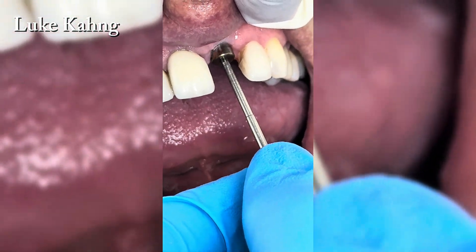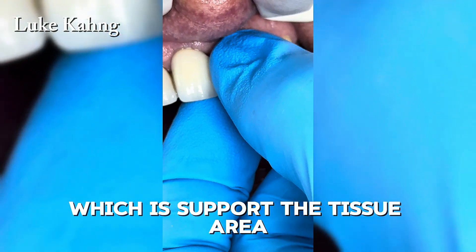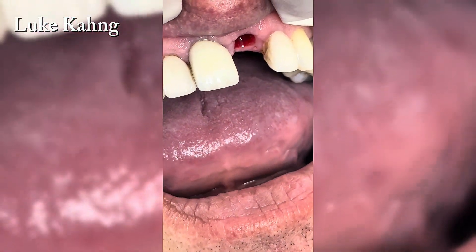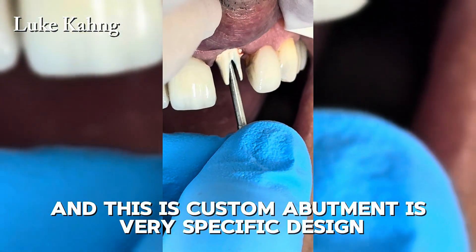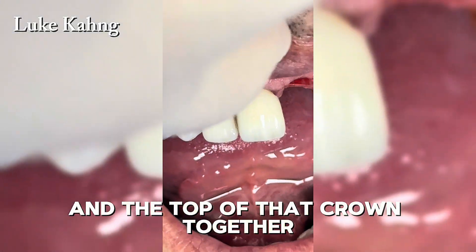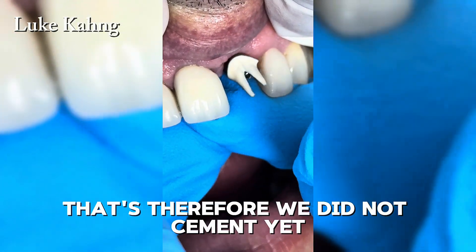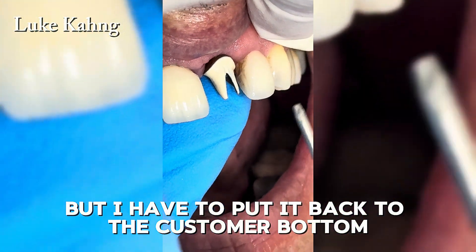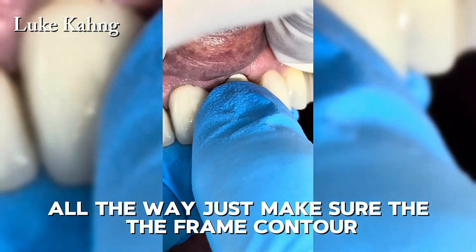First, removing the healing cap which supports the tissue area, then taking it out gently. Now putting the custom abutment back in the patient's mouth. This custom abutment is very specifically designed for the tissue size and the crown on top. We are trying it in first, so we have not cemented yet, but putting it back with the screw down all the way to make sure the frame contour is correct.